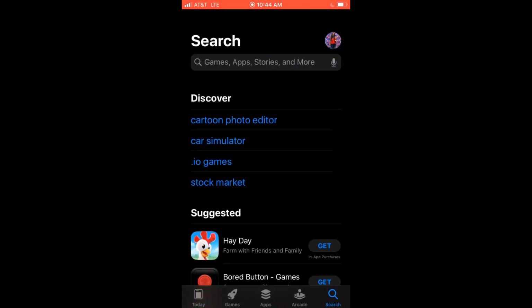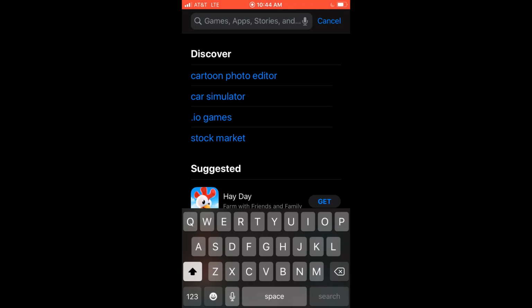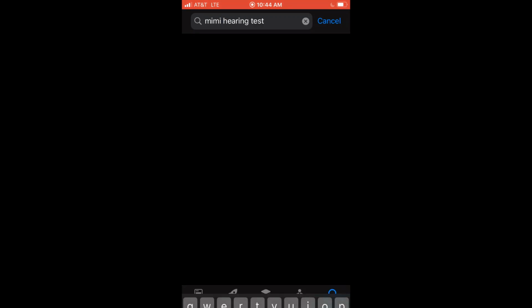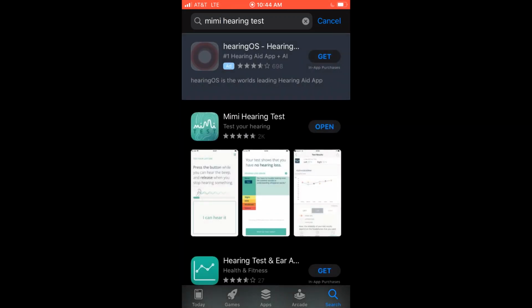And then at the top, you're going to start typing in Mimi hearing test, M-I-M-I hearing test, and it should come up as one of the first things that you see. So you'll click on that. You can see here, it's this Mimi hearing test. I've already downloaded it, so it says open, but it should say get on your phone, and you'll select that.